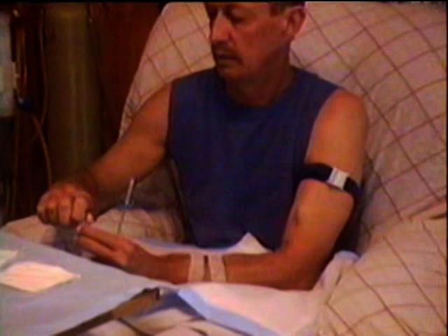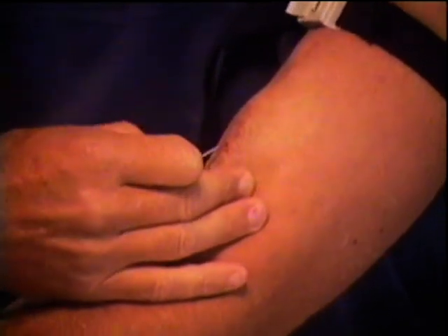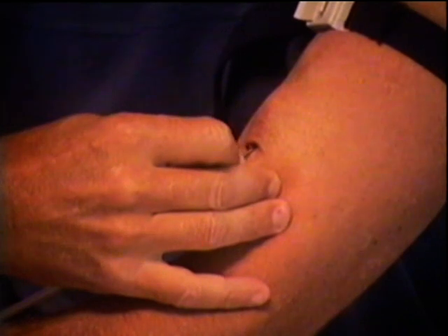A minute's about up for this side, so we've got the second needle. Just check the cap on that, take the end off. Tighten the tourniquet, and because my vein's a little bit twisted, I have to straighten my arm. Can you see that? And put that in the vein.